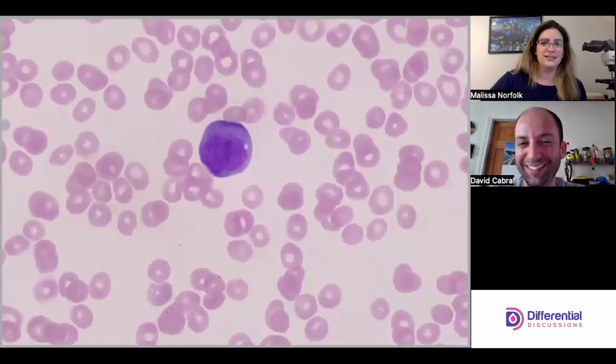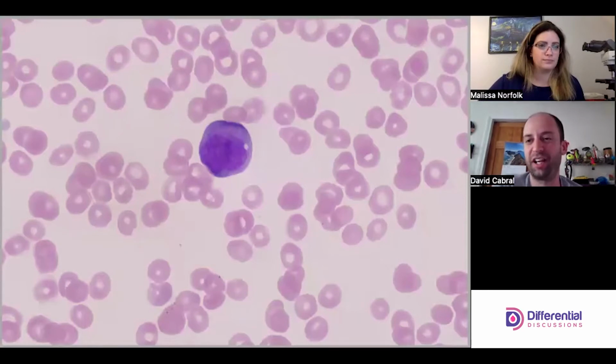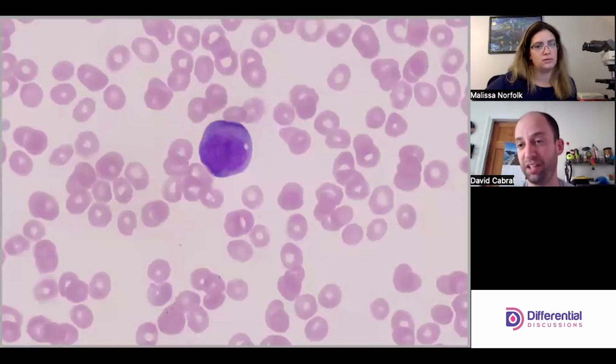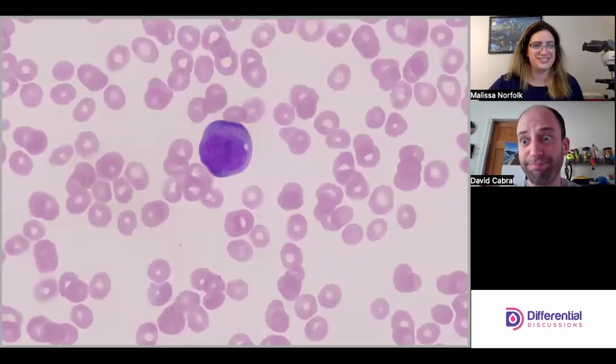I know. So today we're going to talk about acute promyelocytic leukemia. And I would argue that this is one of my favorites. I think it's one of the more straightforward. It depends on the presentation, of course, but this particular slide we're looking at, I can do this. Well, the hypergranular variants are easy. Right. It's the microgranular variants that are terrible.